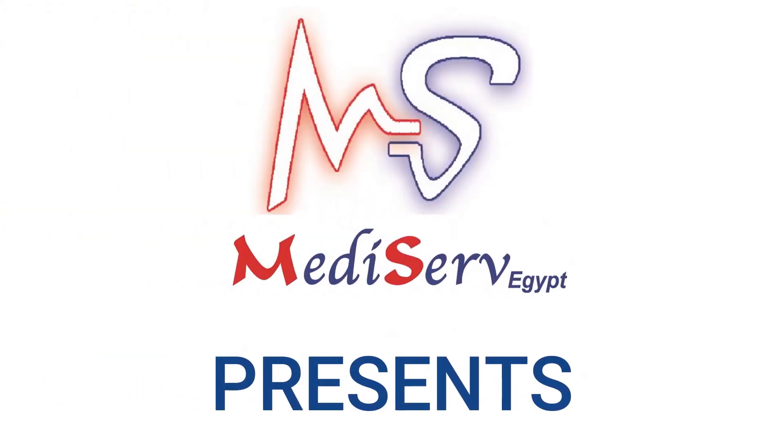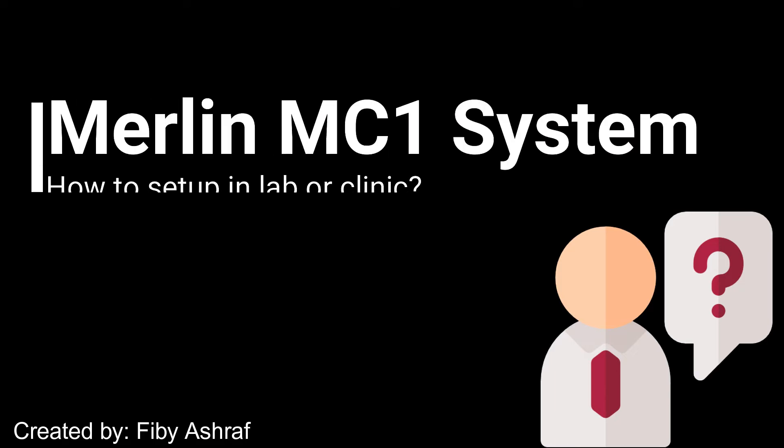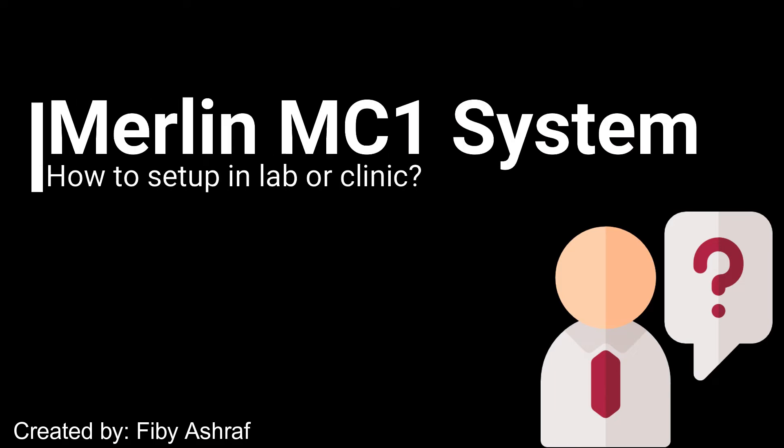MediServe Egypt Company Presence. How to Set Up Merlin MC1 in a Laboratory or a Clinic.